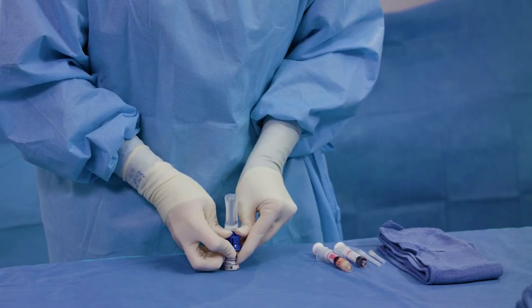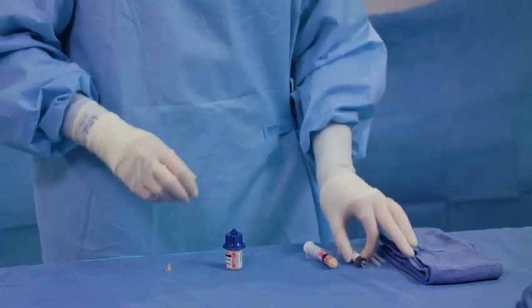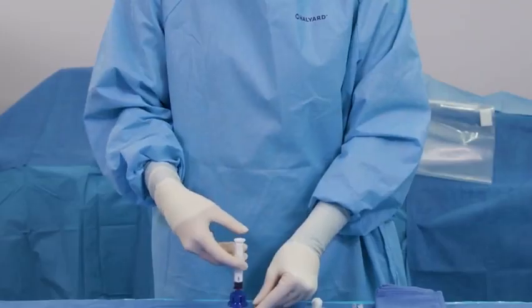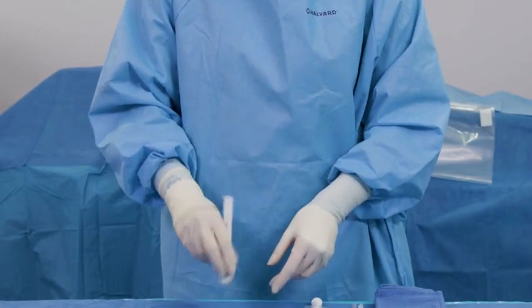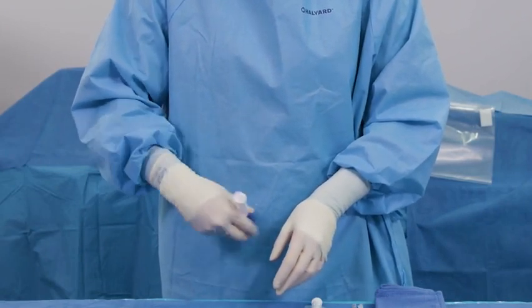If needed, squeeze the ampoule to expel the remaining contents into the vial. Remove the ampoule and attach the empty syringe provided in the kit. Facilitate reconstitution of the thrombin by holding the vial and gently swirling it until the thrombin is completely dissolved.